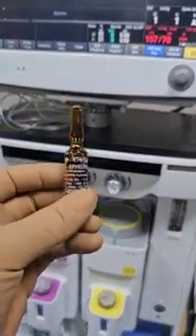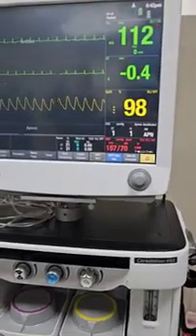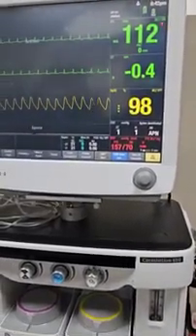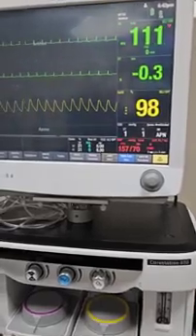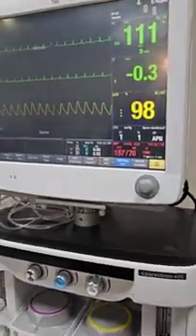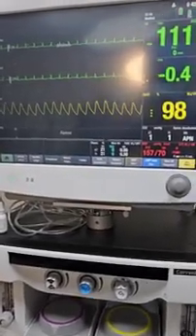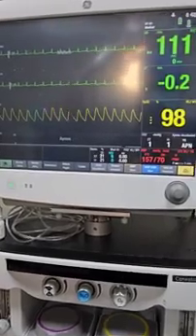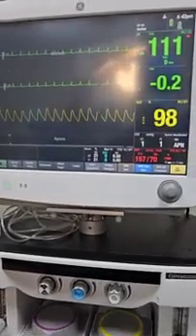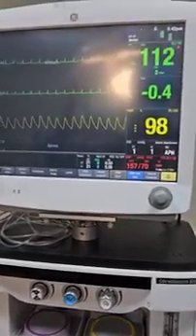ephedrine. Yeah, ephedrine is in our hand, but we are observing that there is not a high reduction of blood pressure. The mean blood pressure is 100 and systolic is 157 by 70, so it is in our range and we are completely okay. We are giving a total of 3.5 ml of volume in the CSF space and not having a huge depletion of blood pressure.